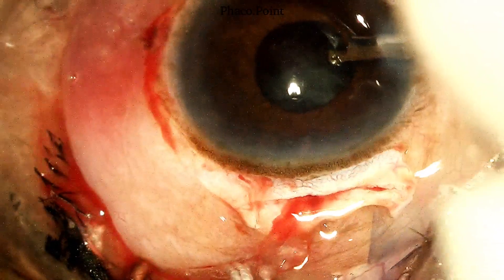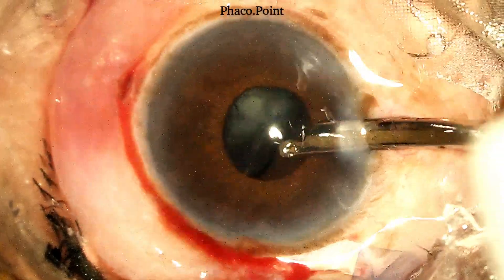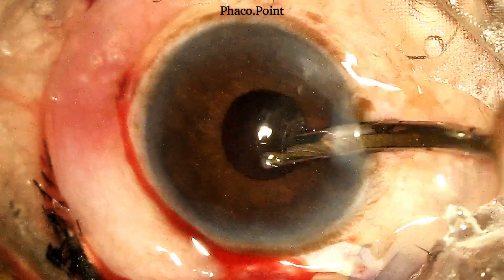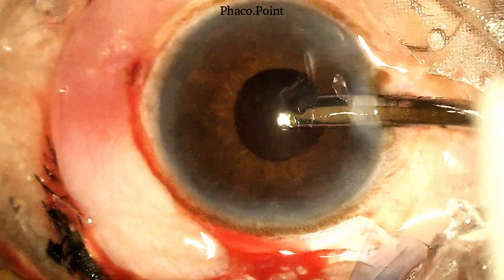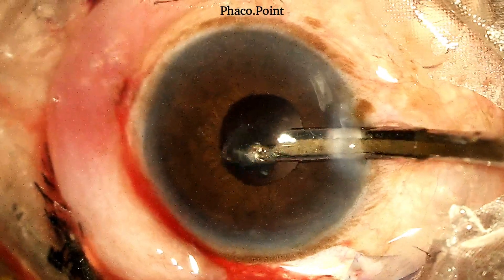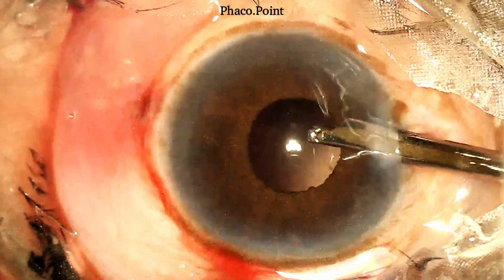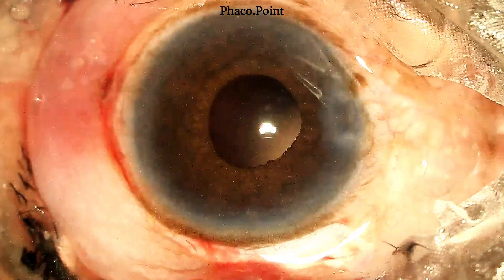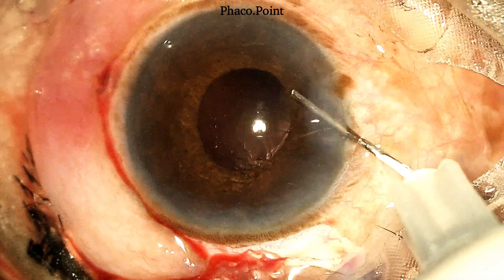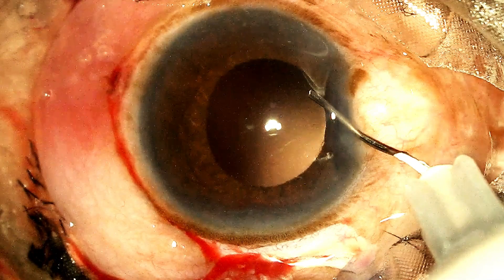For removing the sub-incisional cortex, the SIMCO is introduced through the paracentesis incision and the cortex is drawn out and aspirated. This now completes the cortex wash. Viscoelastic is introduced into the anterior chamber. You get a viscoemydriasis and you can see there doesn't seem to be any more residual cortex.